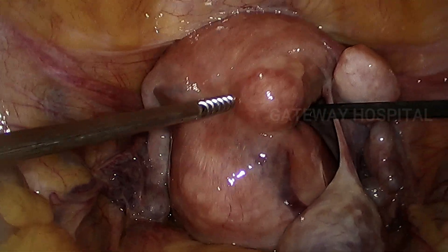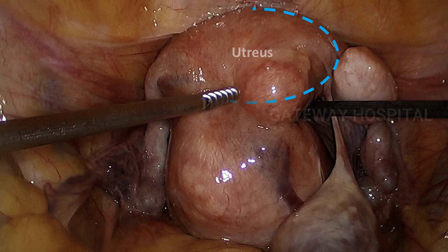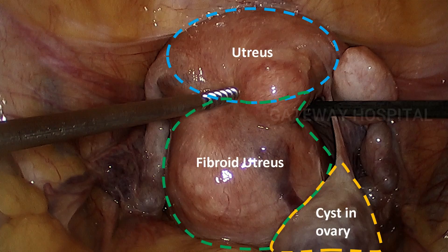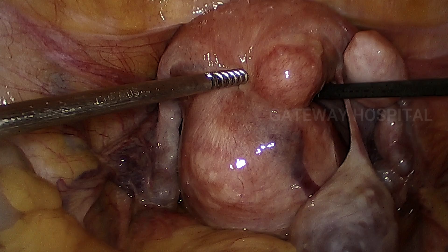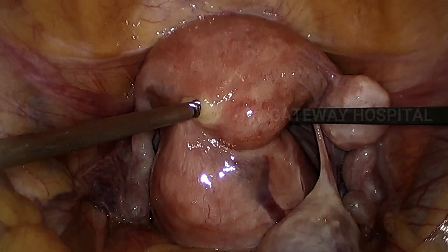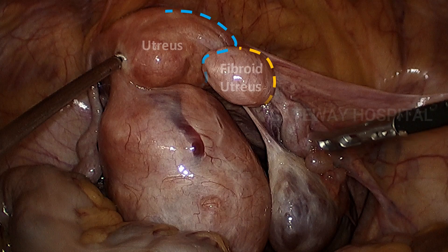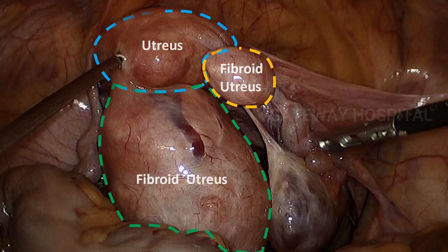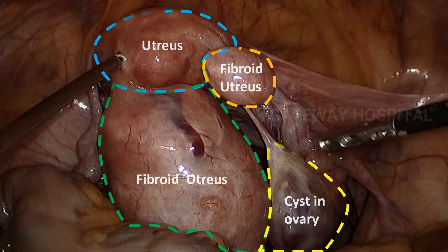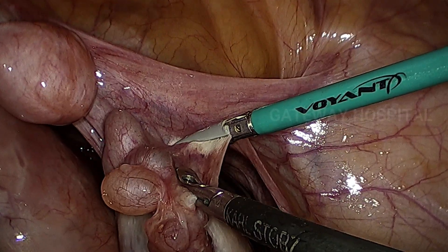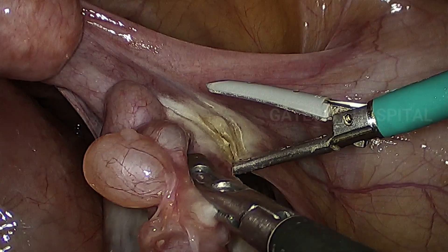This is a case of large fibroid uterus. You can see the uterus and the large posterior fibroid, and there is a cyst in the right ovary and one more fibroid on the right side. You can appreciate the anatomy here: uterus, posterior fibroid, and another fibroid. We are using the Voyant system, which is from Applied Medical.